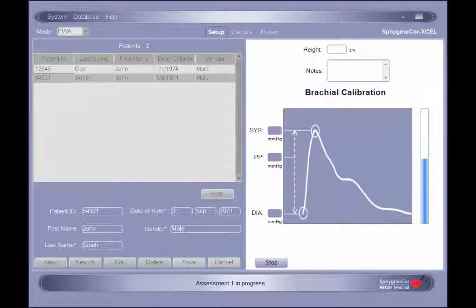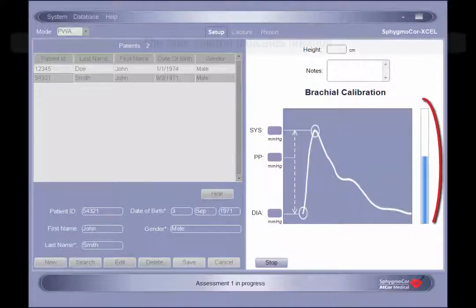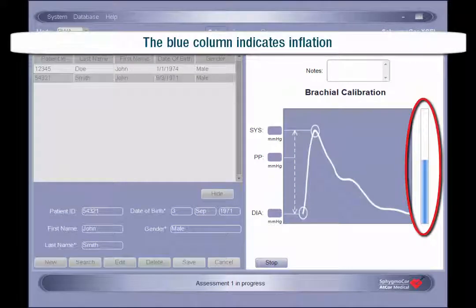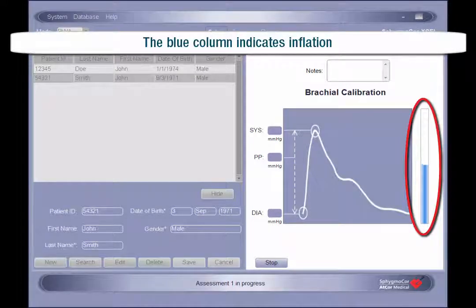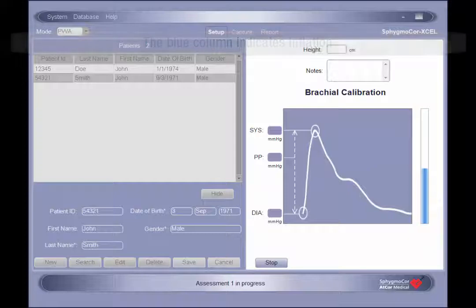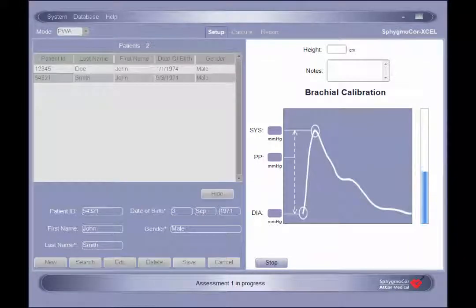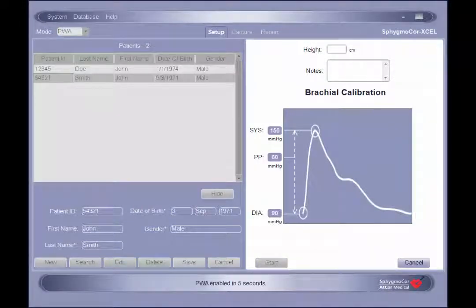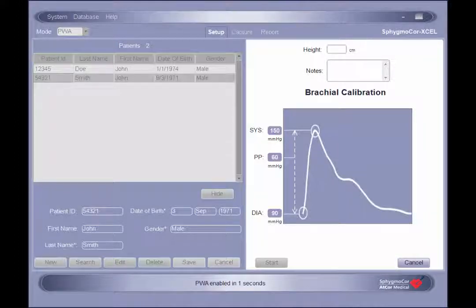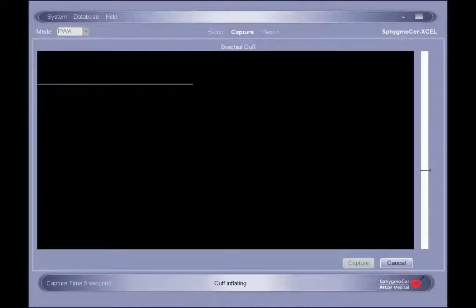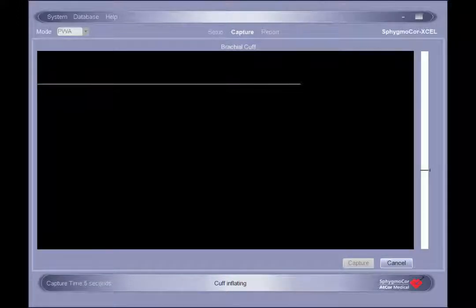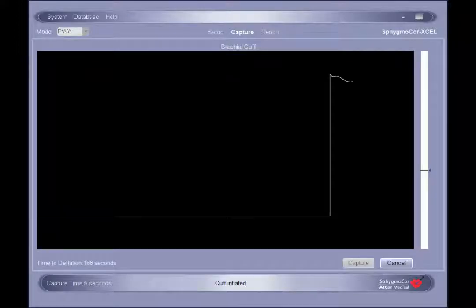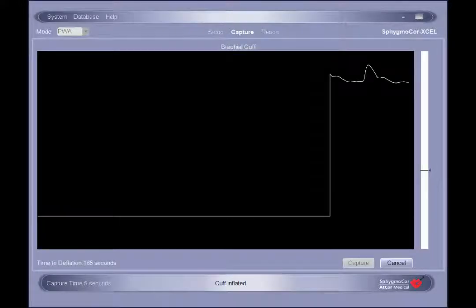During cuff inflation and deflation, a blue column will appear to the right of the waveform graphic to provide a visual indication of the change in cuff pressure. Once the brachial pressure measurement is complete, there will be a 5 second delay before the cuff automatically begins inflating for pulse wave analysis capture. Initially, during cuff inflation, there will be no immediate response on the screen. Once the cuff completes inflation, it will remain at the determined pressure and record the waveforms generated from the brachial artery.